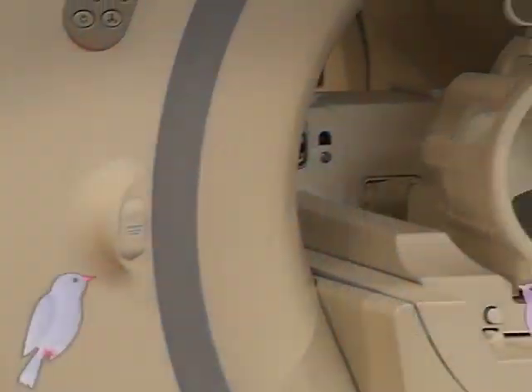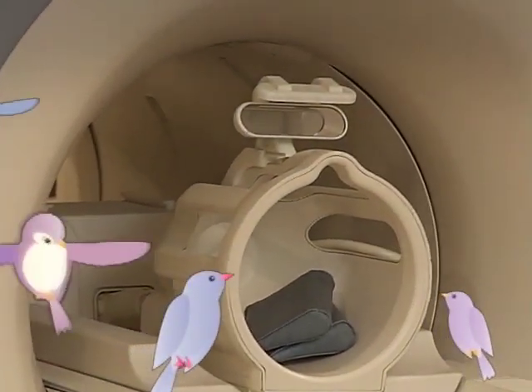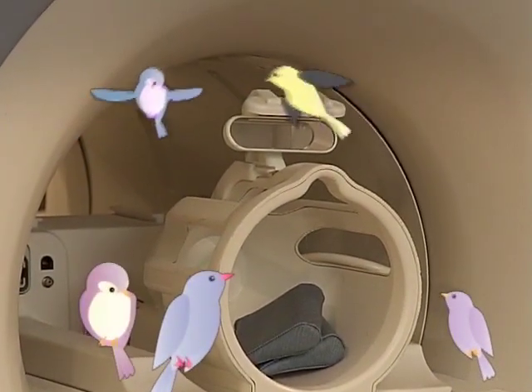It even makes a funny chirping sound. Just like when you pose for a picture with your family, you won't feel a thing. You also won't have to smile, but you will have to stay still. You may even want to take a nap.